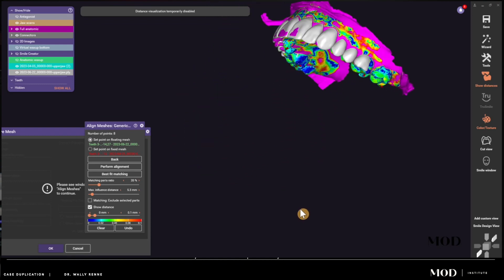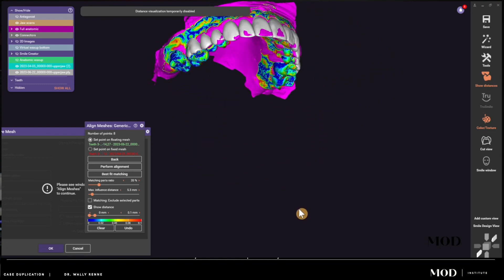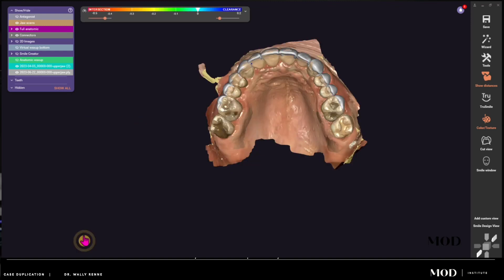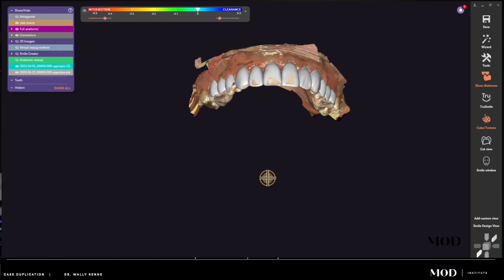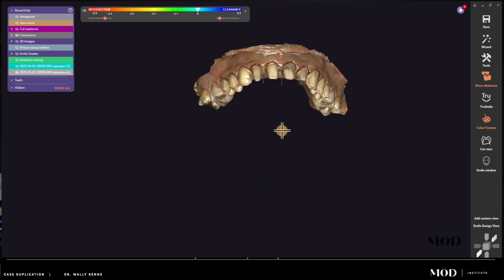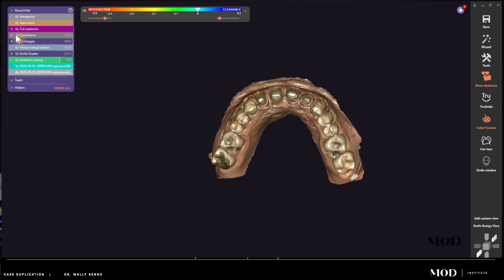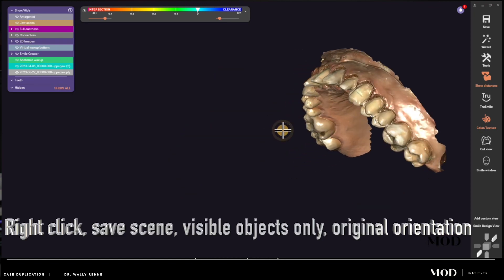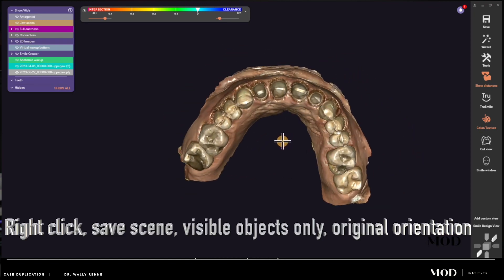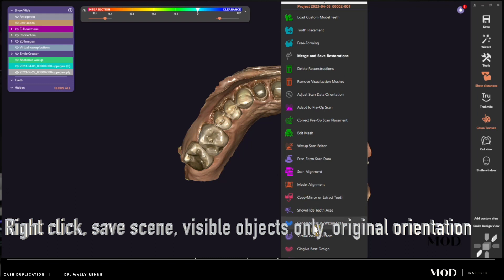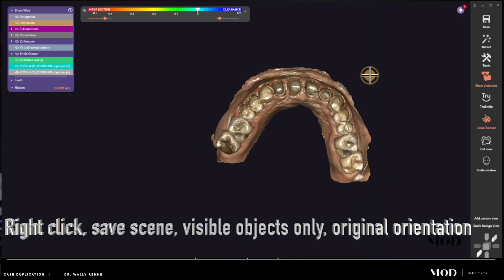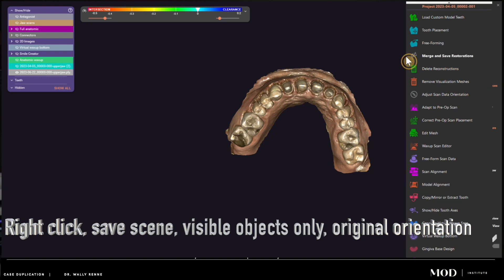I'm aligning my tooth preparation scan to my original mock-up scan. We have a leopard pattern with a good indication of a proper alignment. This is one of the most important workflows I use in my practice, whether it's a 10-unit case like this or a full arch case. This is how I'm able to do day-of-preparation designs in a matter of 10 minutes without redesigning cases.